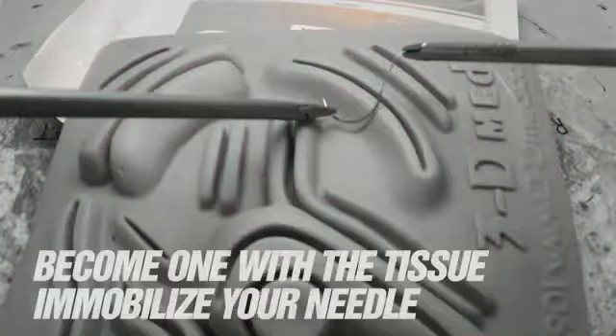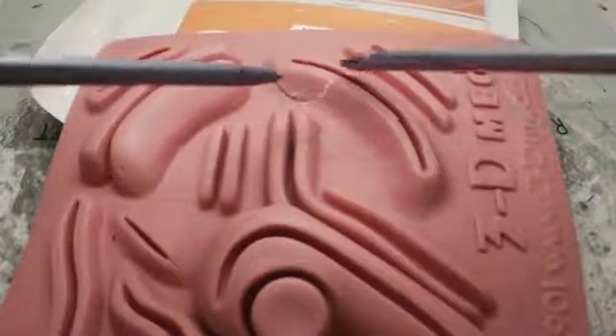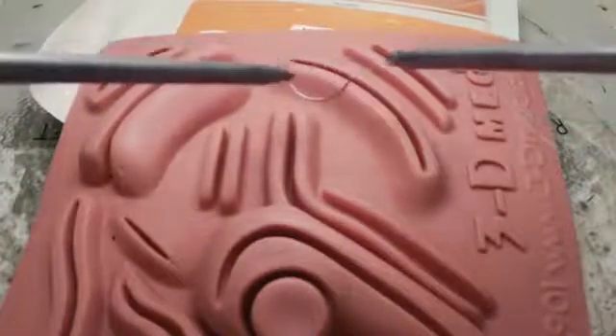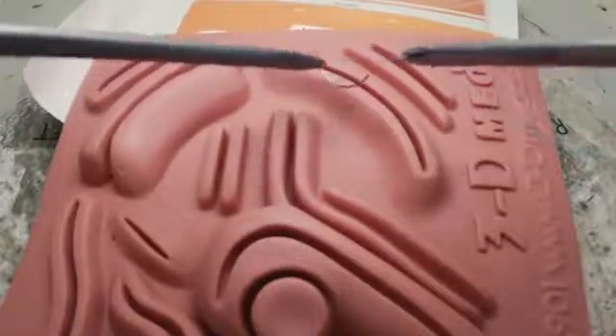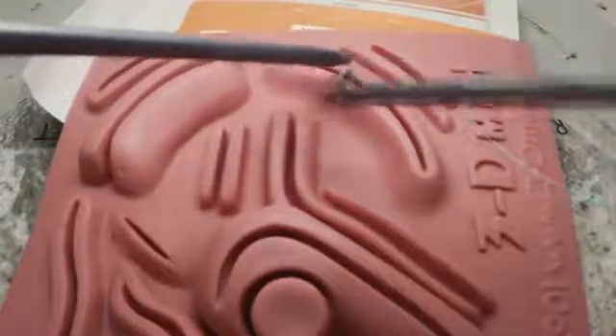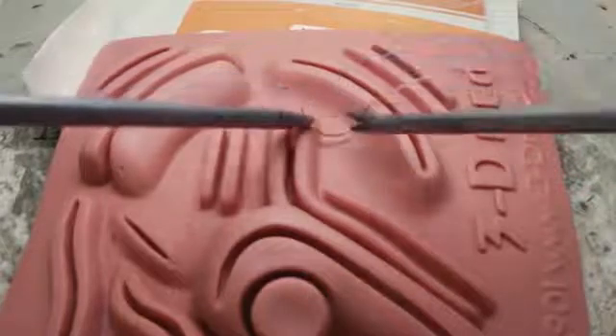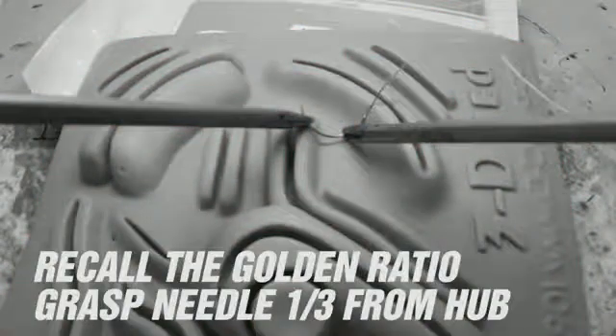Once inside, you should rest the needle on the tissue — it's easier to pick up something stationary. Close the jaws gently to allow rotation of the needle and repositioning so you can orient the needle parallel to the line of tension you're hoping to create in the tissue. Grasp the needle approximately one-third of the way from the swedge for maximum tissue penetration without undue torque on the needle.